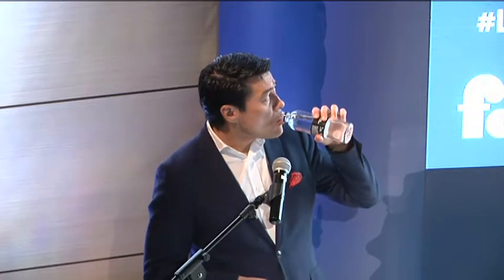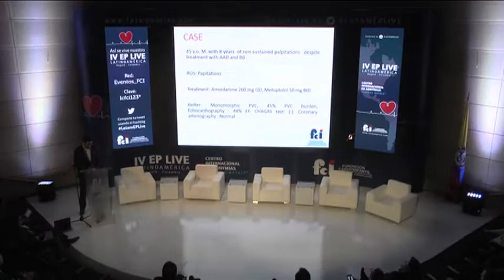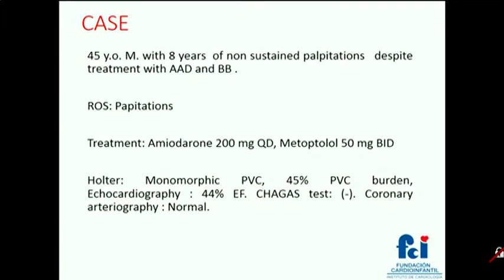This case is a 45-year-old male patient with 8 years of non-sustained palpitations despite treatment with beta blockers and antiarrhythmic drugs, without achieving proper control of the palpitations.